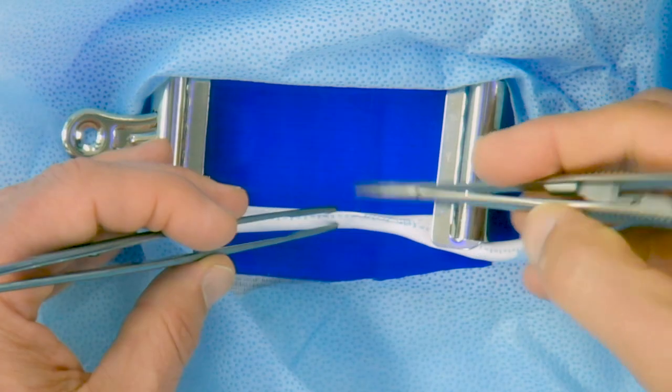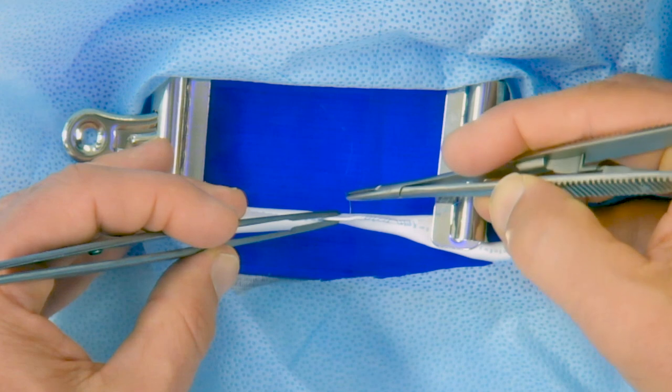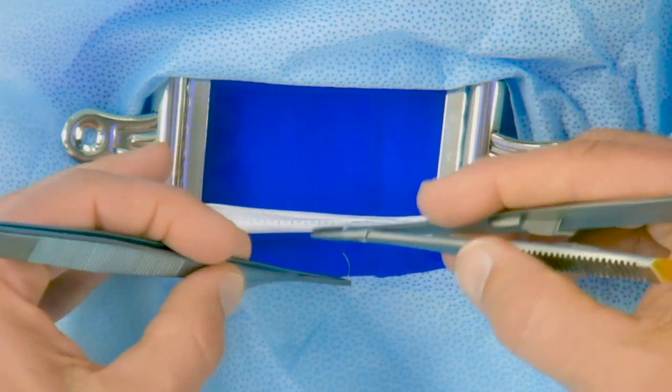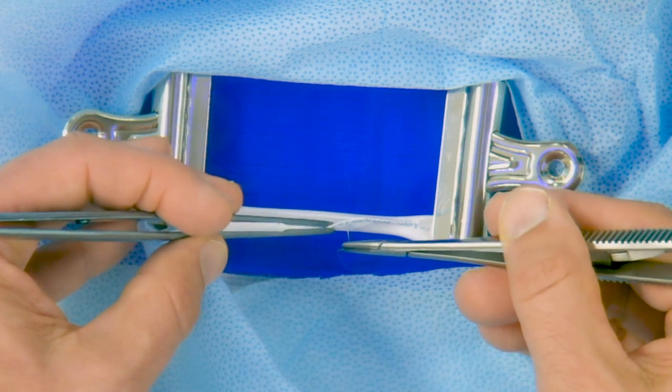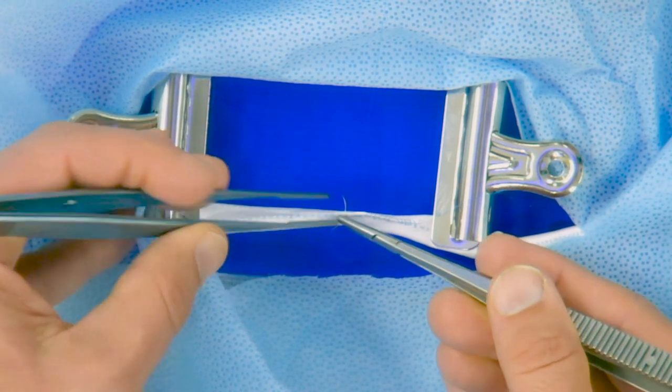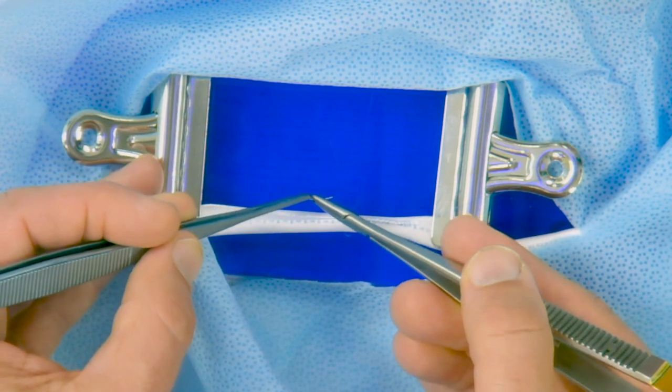After practicing backhand, it's now time to take it to the next level and switch backwards and forwards from backhand to forehand. Notice that we're taking a forehand bite, adjusting the needle, and now taking a backhand bite. This is very common in vascular surgery and very helpful if you're prepared to do this.